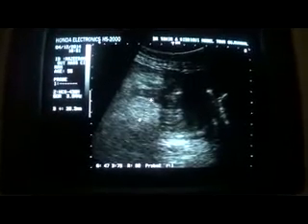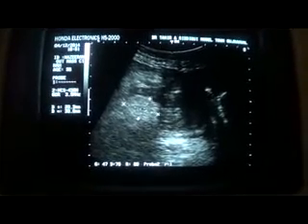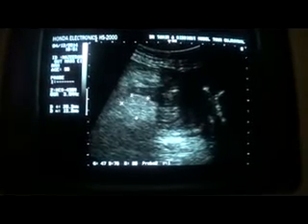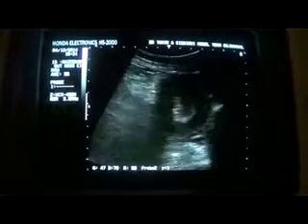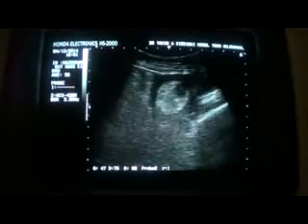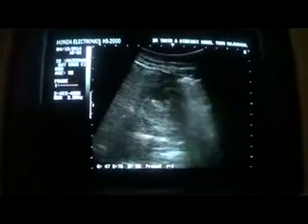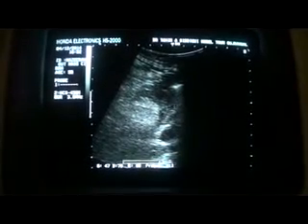approximately measuring 2.0 by 3.0 centimeter dense, coarse, highly echogenic area, well demarcated, and this is at the distal end of this bowel-related pathology. This area, it also moves. This is the area, this region.